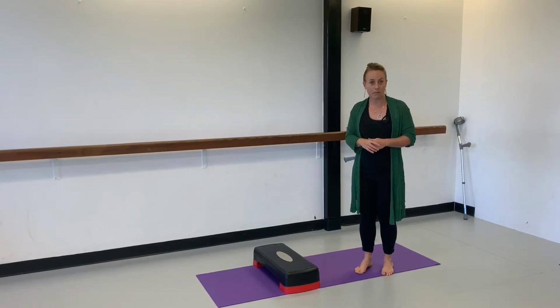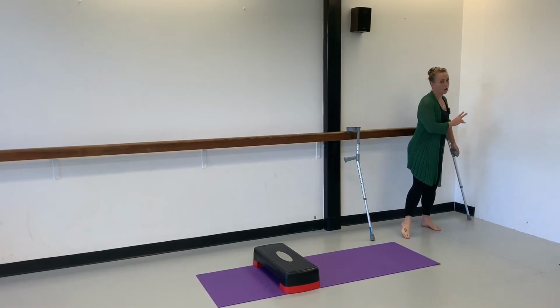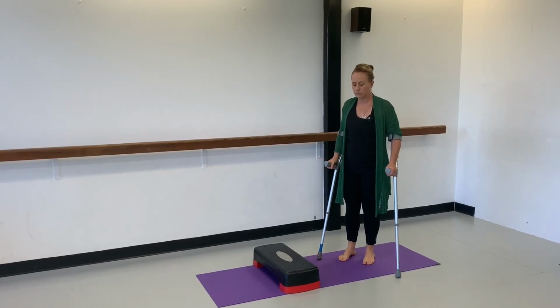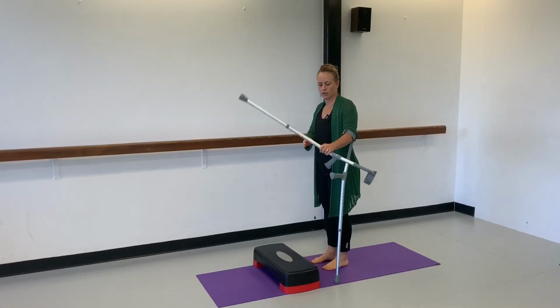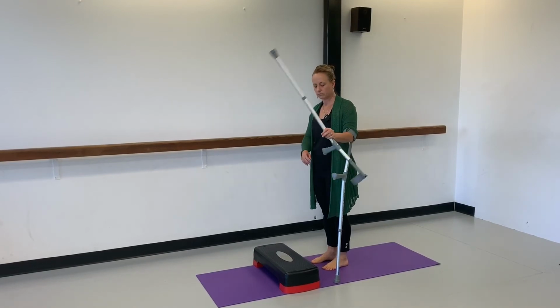Now the last thing I wanted to share was getting up and down stairs. So on 2 crutches, it's a little bit more challenging. I'd always prefer, if you can, to use a rail. If someone is with you, they can take the other crutch, or you can put a crutch in one hand like this if you really need to.